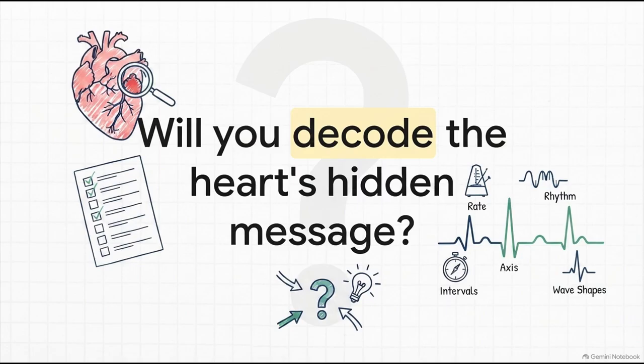Next time a 12-lead ECG is placed in front of you, will you just see a random jumble of squiggly lines? Or will you confidently step up and decode the heart's hidden message? Armed with these structured detective skills, I have a feeling you're fully ready to solve the case.